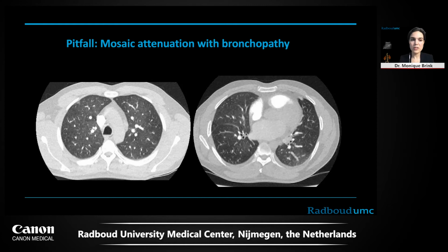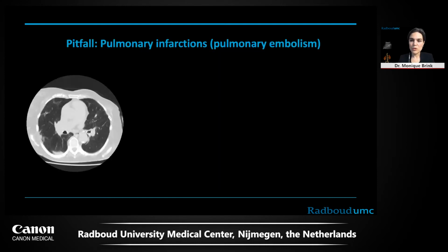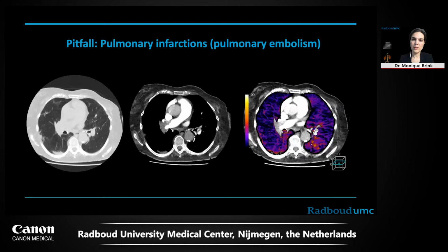This is mosaic attenuation. Check the important clinically relevant pitfalls, such as in this patient who has bilateral densities. They're more dense than ground glass alone, but these resemble pulmonary infarctions, which you could have missed if you had not applied intravenous contrast in this patient. So be aware of that. Consider whether or not the patient can have pulmonary embolism.